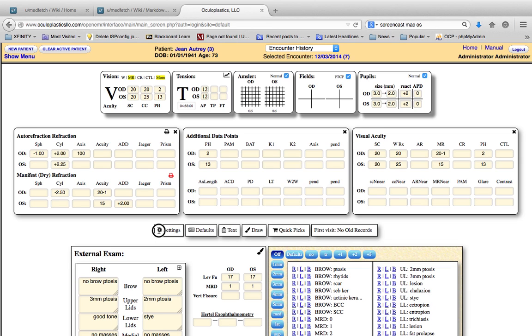I may remove it. It's there because, well, it looks good, and there may be settings that you want to override, settings that you choose. I'll explain that later, but let's look first at the vision.